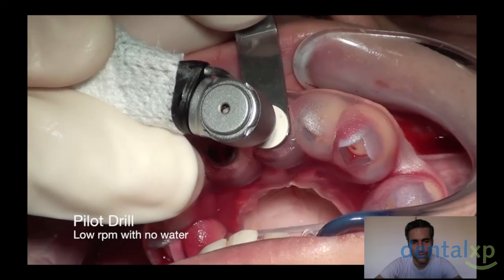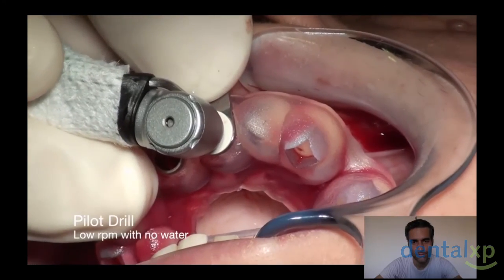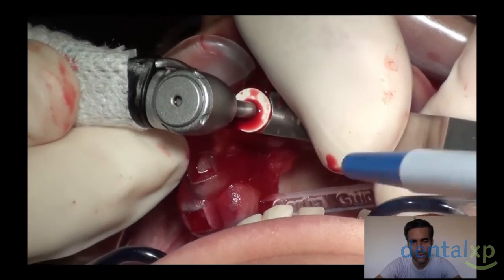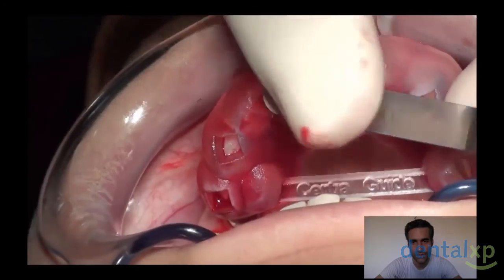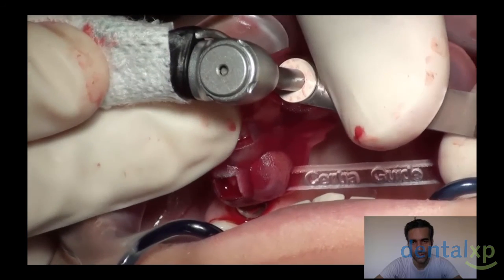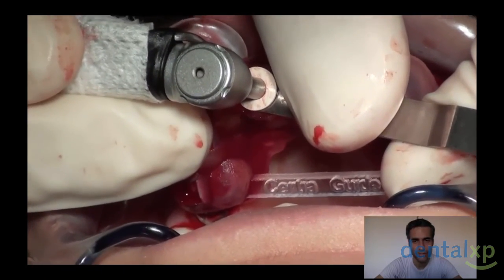Here it is, we are drilling with biological drilling, no water. It doesn't make sense to use water here because you are not going to cool your drill beneath that tool. So we keep going with our drilling protocol.